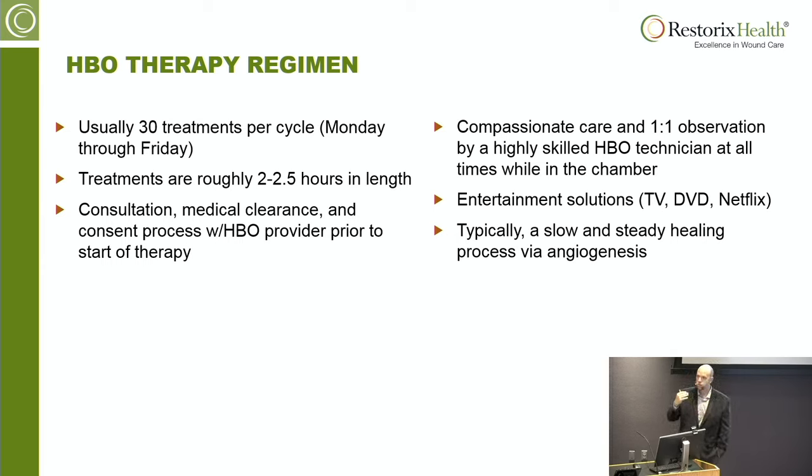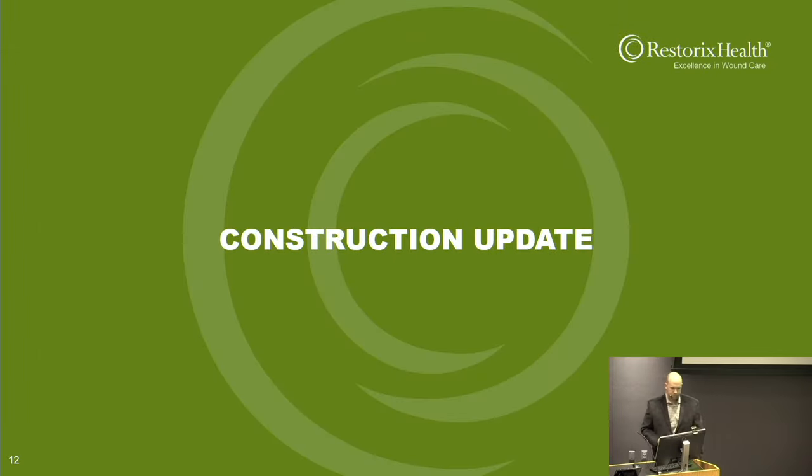And if you want to experience what they're experiencing, jump in an airplane. When you get up to 30,000 feet, the cockpit is pressurized. I mentioned they're flying hyperbaric chambers, not to the pressures we go to, but you experience the same phenomenon, that pressure in your ears. So we educate the patients on how to yawn and chew and wiggle their jaw and equalize, but a percentage of them may need tubes from ENT, little tiny tubes like kids get, to allow that pressure change to happen automatically. But all in all, it's a pretty mild, gentle therapy, with pretty minimal side effects.